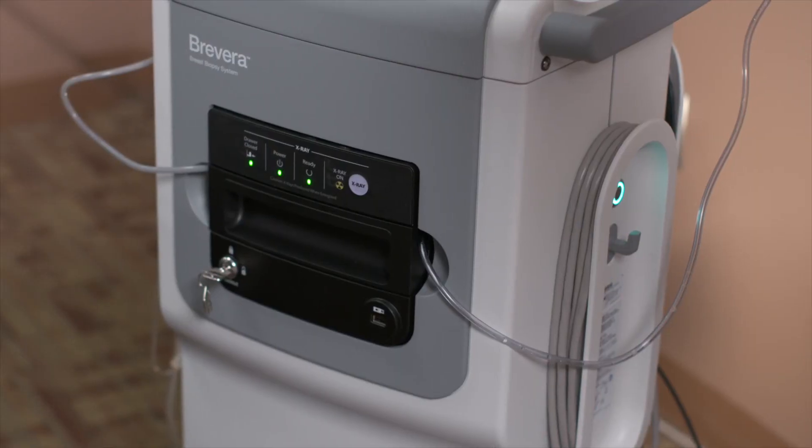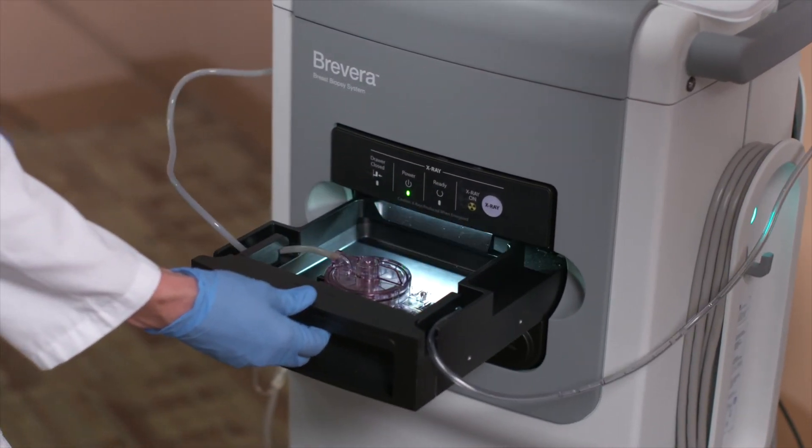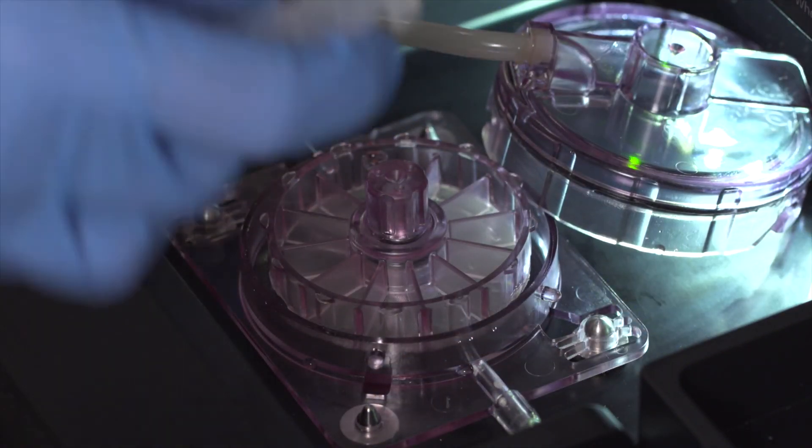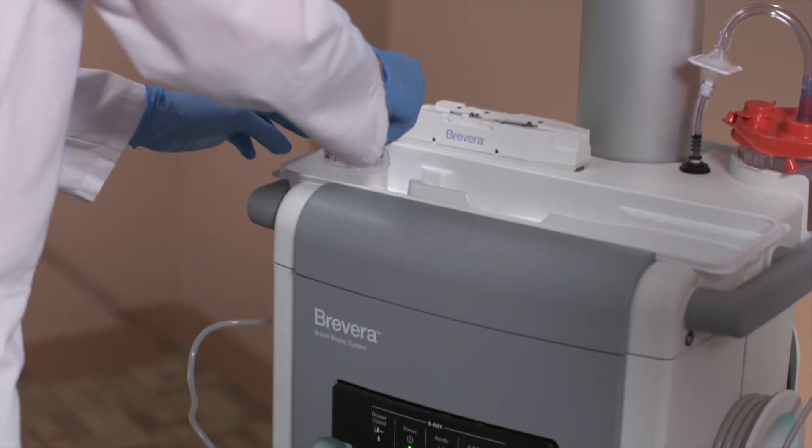To prep the specimens, the technologist will open the drawer, twist off the tissue filter assembly cover, place the tissue filter cap over the filter, remove the filter, and place in formalin jar.